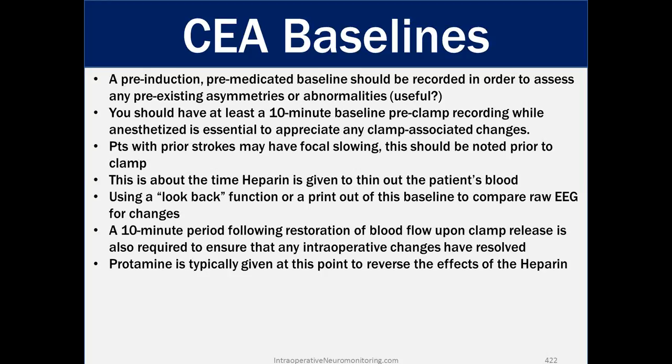A 10-minute period following restoration of blood flow upon clamp release is also required to ensure that any intraoperative changes have resolved. So you saw that one picture: clamp off, anesthesia, put on some high gas, and we saw some slowing right away. At that point, if anything happens afterwards, we're useless. We can't tell any difference. So it's recommended you have at least 10 minutes of recording good waveforms after the clamp is released. And talk to your anesthesia team about that as well.